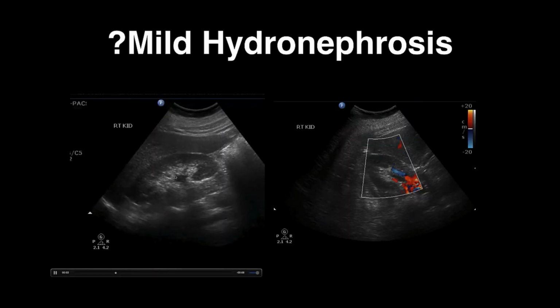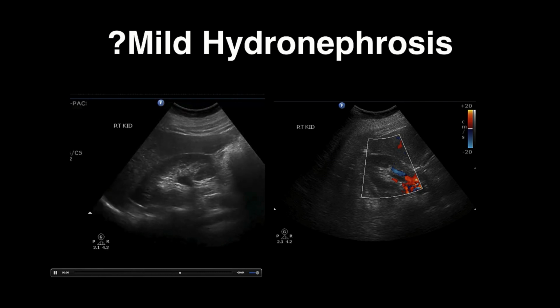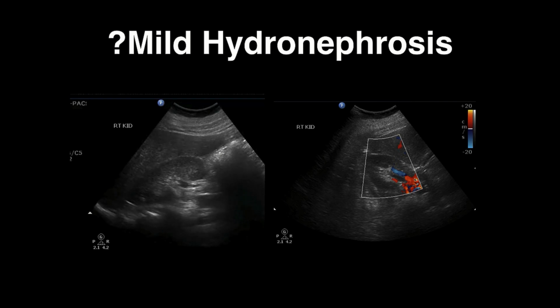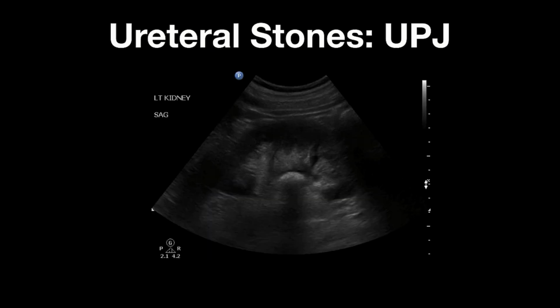Whereas on this patient, it looked very similar, and I'm thinking, well, maybe this is hydronephrosis, maybe this is just a prominent vessel. I go ahead and I go transverse, and I put Doppler on, and I can see vessel, ureter. So this is a patient with true hydronephrosis.